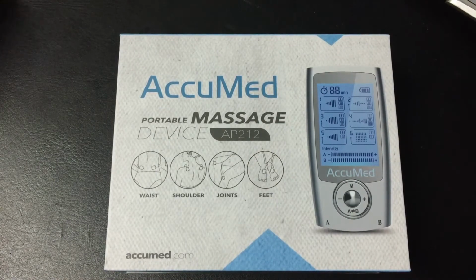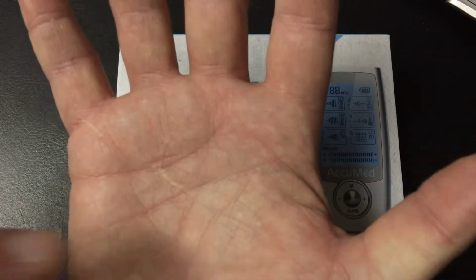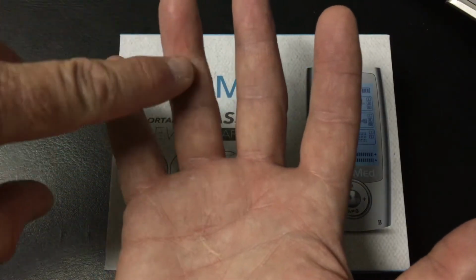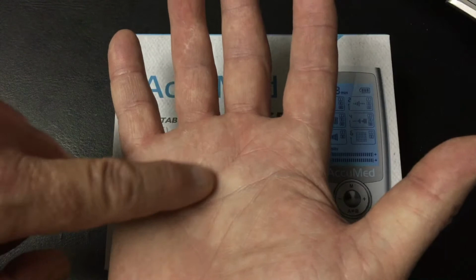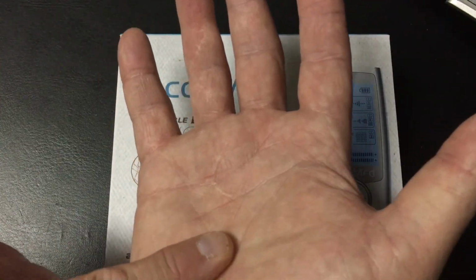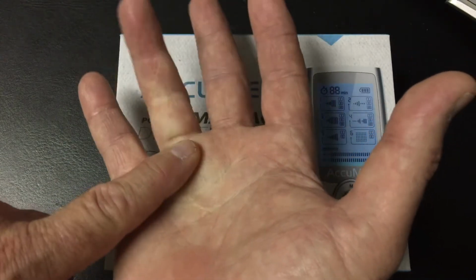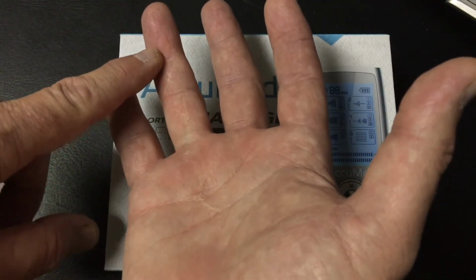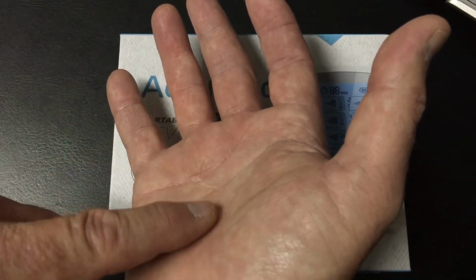I'd like to give you a quick example of one way that TENS is used. I was first introduced to this in 1999 when I had a rollover automobile accident. I'm going to show you with the hand that was affected. You'll see there's a scar here and on this finger. What happened was my flexor tendon detached from this joint, and it was coiled in my palm. Long story short, they did surgery and reattached the tendon, and part of my therapy and rehabilitation was using a TENS unit to give flexion to this finger to enable the finger to work properly, and to also exercise that tendon so that scar tissue was not building up around it.